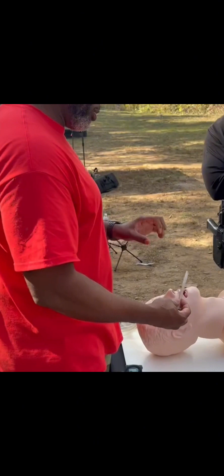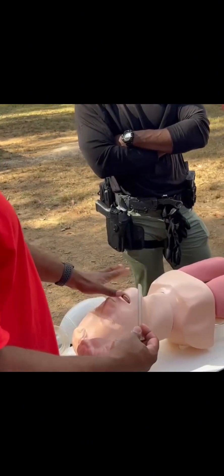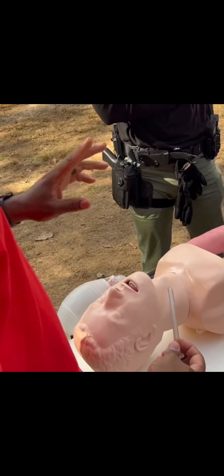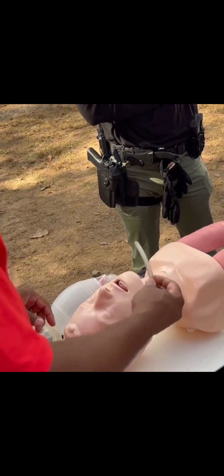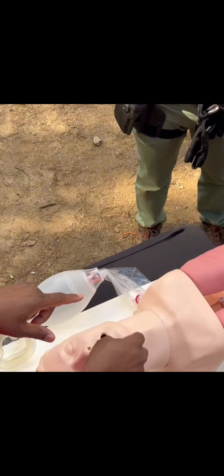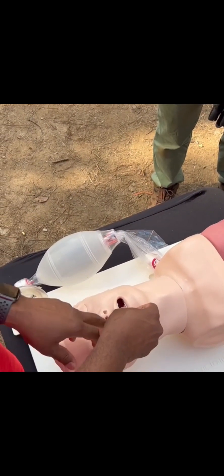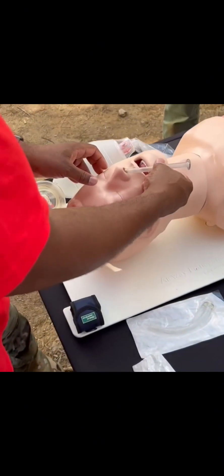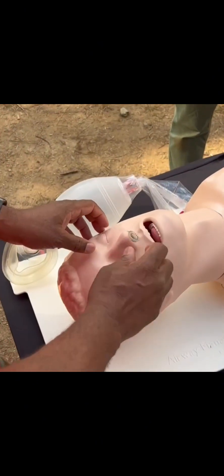Most of the time on mannequins they're not lubricated, but on a real person the nose is not as dry. If it is dry, people think it's disgusting, but you actually take it, put it in your mouth, and use your own saliva — that's what you do. People say it's not sterile, but it's not going to be sterile anyway. And then you take it and go — that's literally all you do.